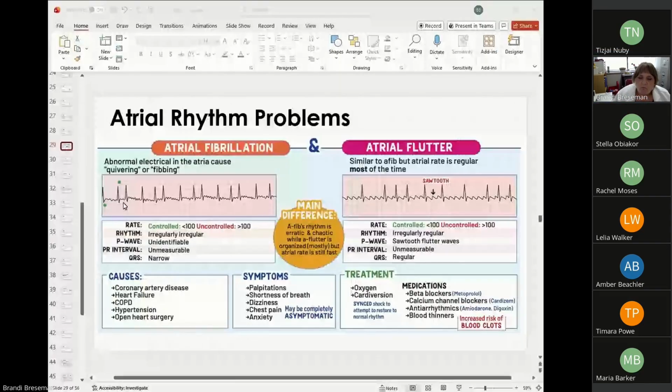Now, I can go in and measure my QRS. I can't see these blocks, to be honest with you, because this is tiny. But if I had to take a guess, I'd say maybe there's 2 small blocks, so I'd put it at maybe 0.08, which is normal. Or maybe even less. I don't know. It might be less, but my QRS is okay. It's within normal.